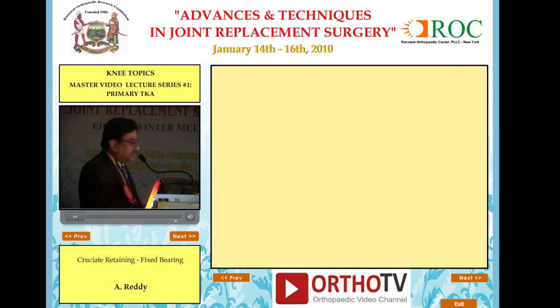In the tibial side, that is the PCL. That is the PCL is still there. And the rest of the things are very normal. Of course, if you have said in the ligament balancing, if you need, you will balance on the femoral side.